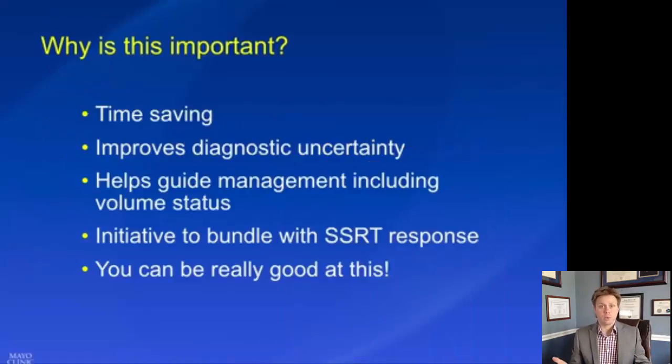So, first of all, why is this important? Well, it helps save time in the emergency department, on the floor, in the intensive care unit setting. It will improve diagnostic uncertainty, particularly when it comes to undifferentiated dyspnea, shock states, and volume status. It can help guide resuscitation. At Mayo Clinic, Florida here, we're now bundling this into our SSRT, or Septic Shock Response Team package. And the other thing is that, although it can be somewhat daunting, it really doesn't take that much practice to get comfortable answering some of the basic questions we're going to go over.